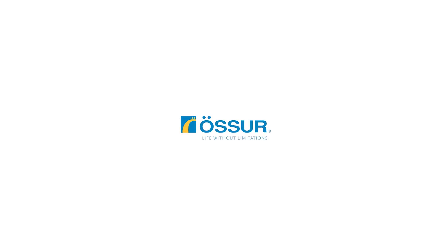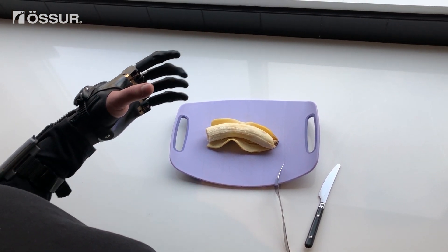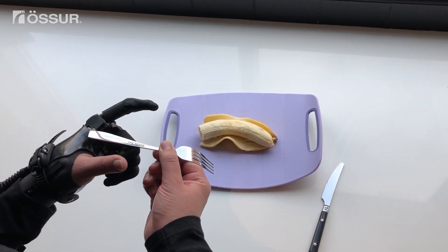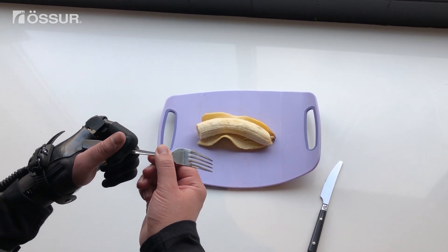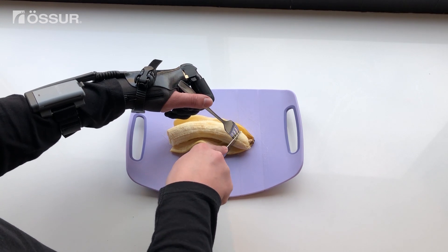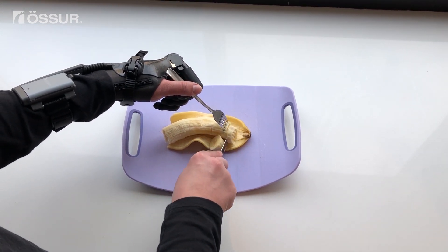To cut a banana with a knife using your prosthesis, begin by extending the index finger and closing the remaining digits. Place the fork tines down with the top of the handle in between the base of the thumb and index finger. Send a close signal to secure the bottom of the handle in between the index and middle knuckles. Cut the banana by stabilizing it with the fork and cutting with a knife in your other hand.